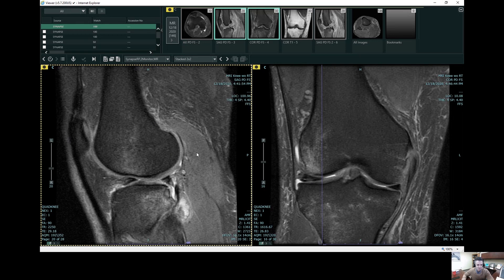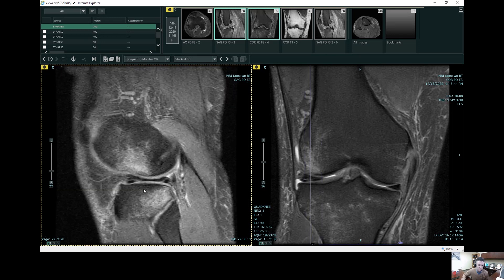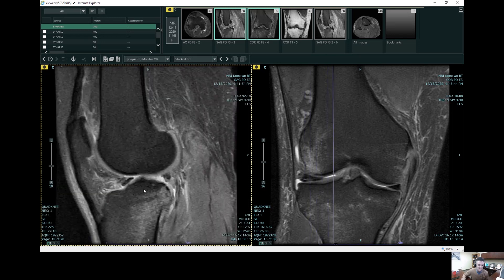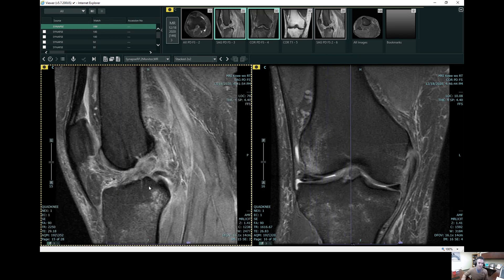This is the back of the patient's knee, or the posterior aspect. This is superior towards the head, inferior towards the patient's feet. This is a patient with a full thickness ACL, or anterior cruciate ligament, tear.